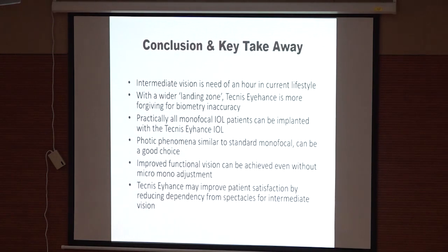So the conclusion and key takeaway from some of these newer IOLs which are coming in is this: we need intermediate vision, and if we can give it to our patients without the problems associated with multifocal IOLs, then this is a good trade-off with the problems that some of these EDOF lenses may also have. Those are not very marked. So these lenses perform quite well and are quite safe to use.